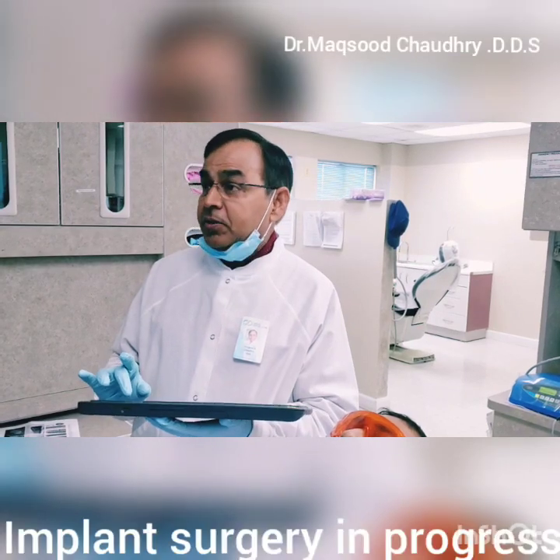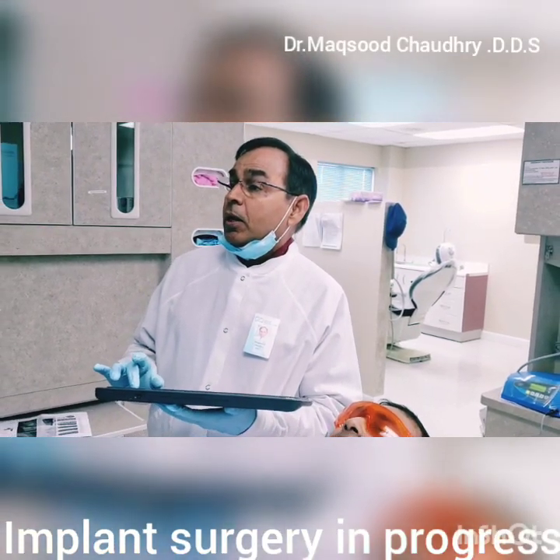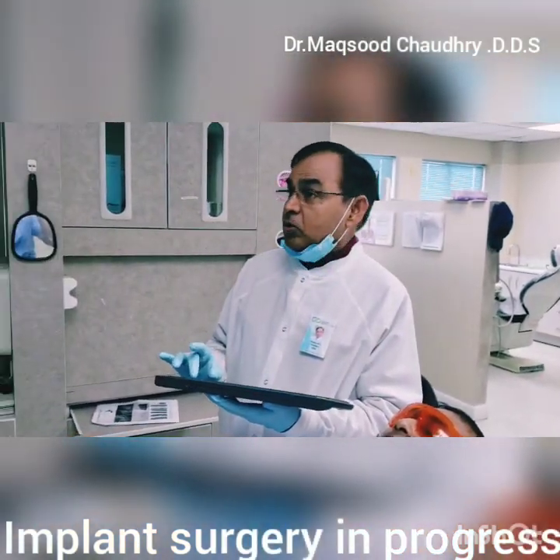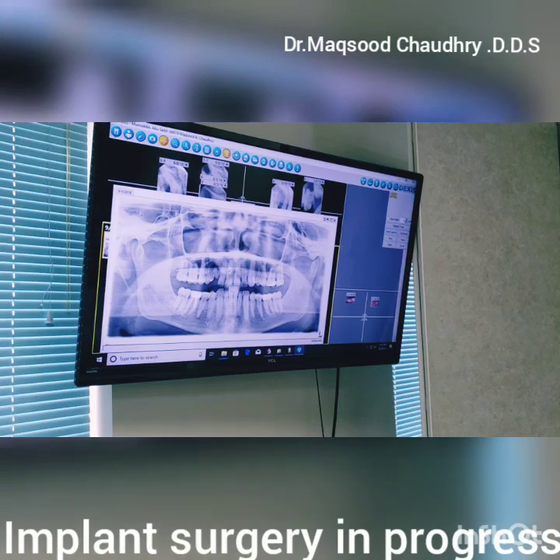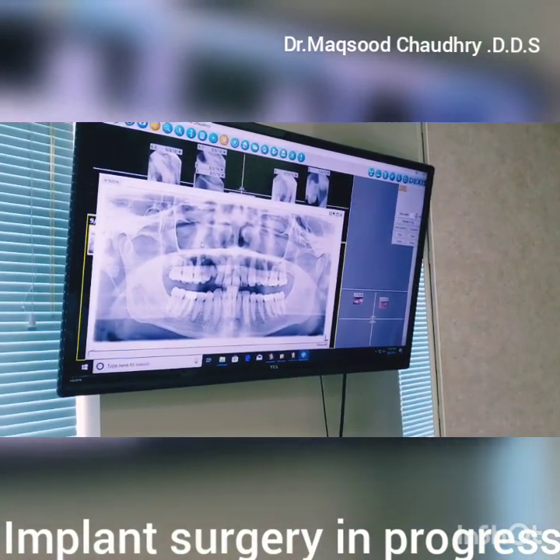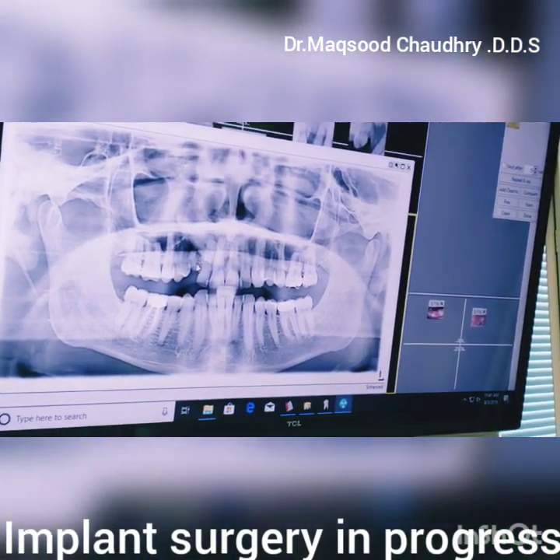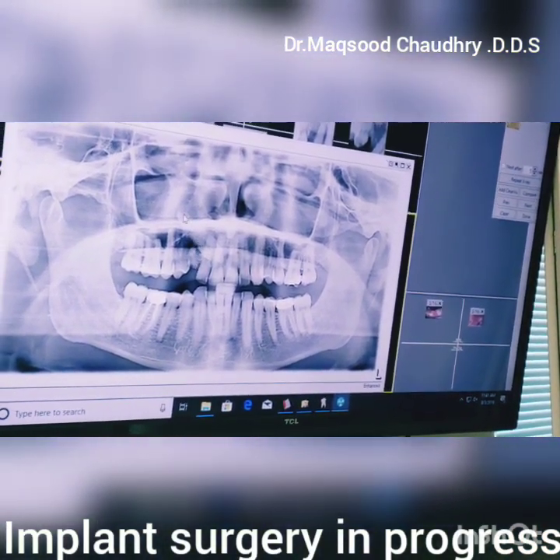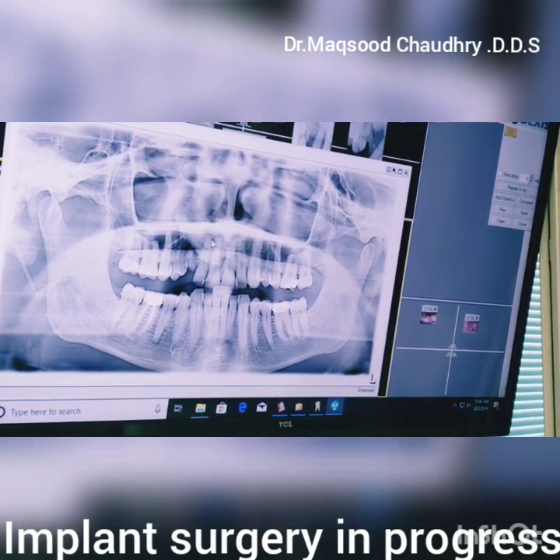By using the surgical stent. This is one of our patients, and this is a panoramic X-ray which shows before the treatment. It shows one cuspid tooth which is lying down, a horizontal impaction. It has very long roots all the way going to the maxillary sinus on the right upper side, and there's still a small baby tooth. So we extracted this tooth surgically and placed the bone graft.